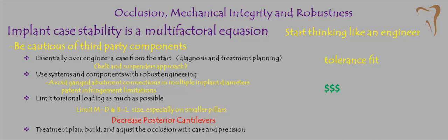If you take a ganged abutment, say in a small diameter, and port it up to a larger diameter implant, you have a thicker wall, but you also have a thinner abutment wall. So I see a lot of abutment fractures in that scenario. Not so much of a problem if it's a larger size implant ported up to a slightly different diameter at the large end, because the components are already a lot stronger. But I really think in terms of that scenario.